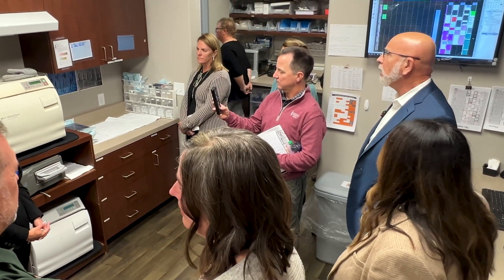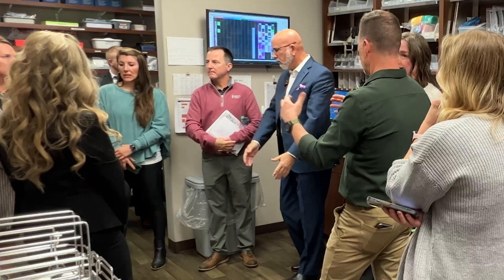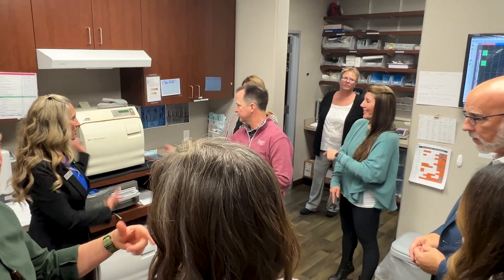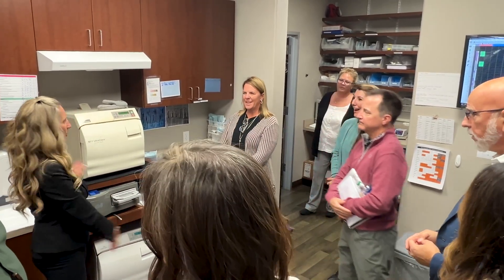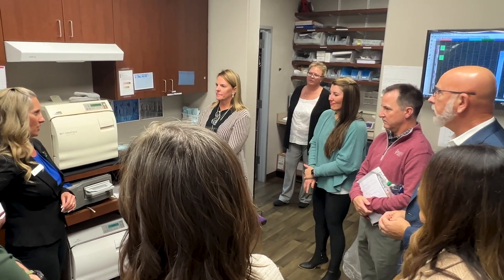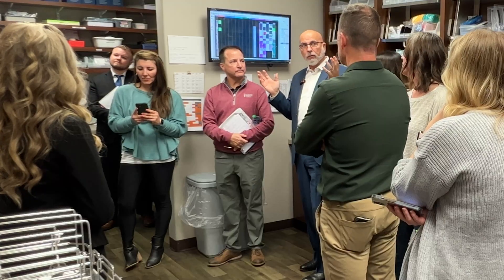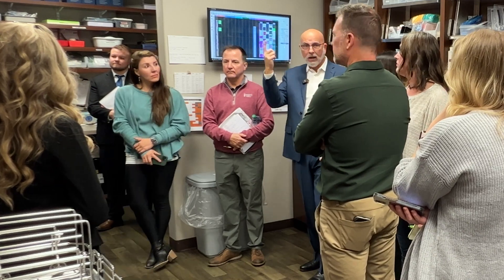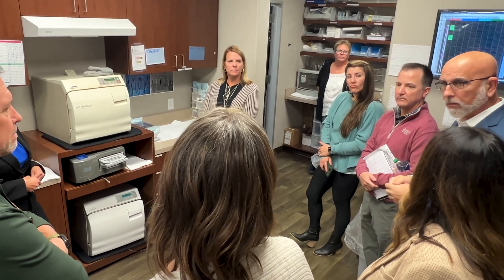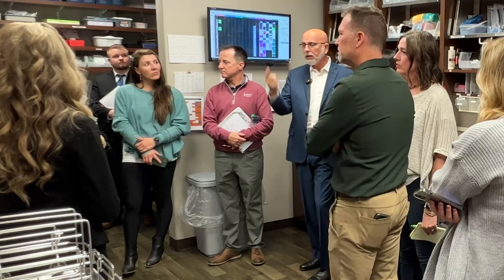We would now have a bigger hood, and it's all metal — this is a stainless steel rack. Because this area is always wet, there's always moisture going on over here, so stainless steel is a much better option with much bigger capacity. You're actually pulling air out of the rest of the office into here, through there and up and out. So there's no odor from here getting out there, which dental people don't notice, but others will. You want to have negative airflow in here.